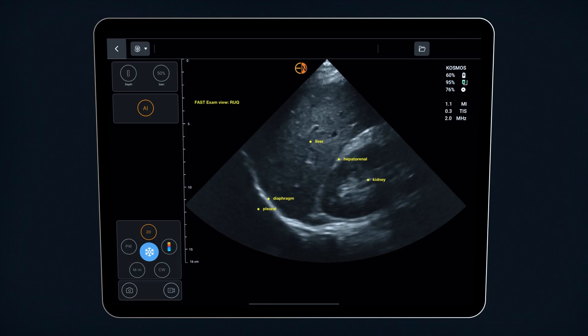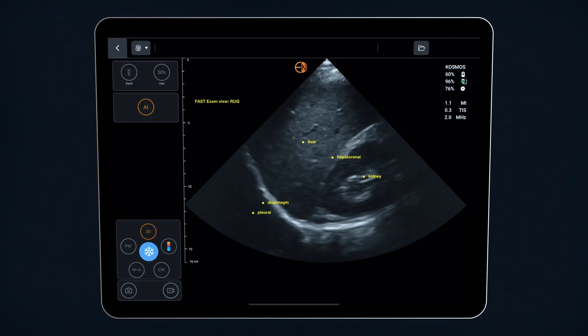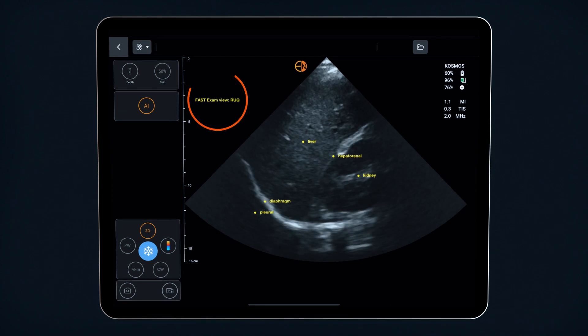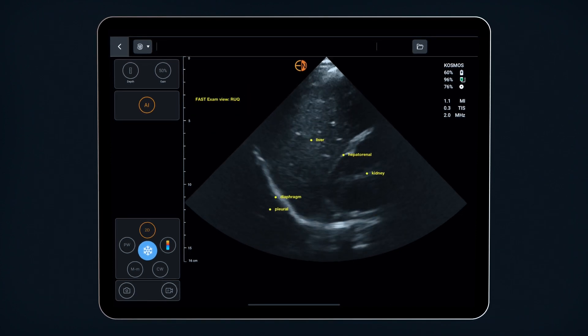FAST stands for Focused Assessment with Sonography and Trauma. It's a multi-organ exam used to assess trauma patients for free fluid. With AI-FAST, the system will recognize the anatomy, provide real-time anatomical labeling, and identify the view as you conduct the exam.